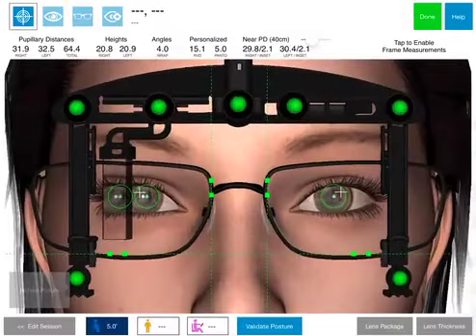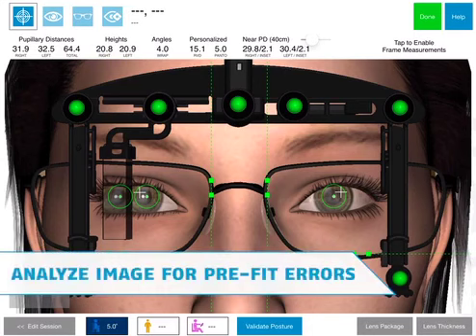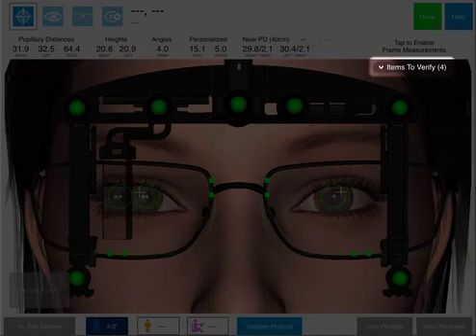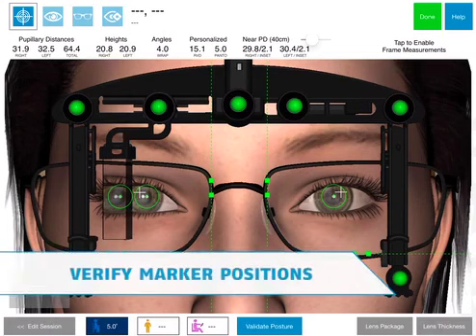It's important to take a moment to analyze the resulting measurement image and verify that the customer pre-fit has been properly performed. In some cases, an Items to Verify list will be displayed. These items should not be seen as errors, but rather an indication that some aspect of the pre-fit might be incorrect and further review is recommended. With the pre-fit verified, you are now ready to proceed with the final step.